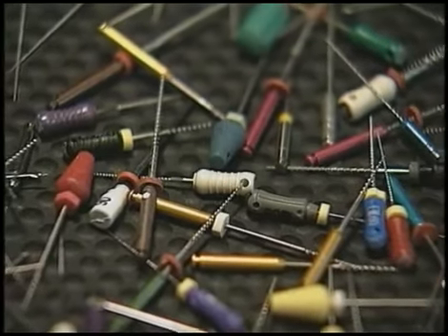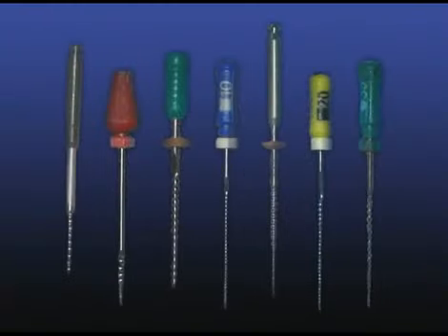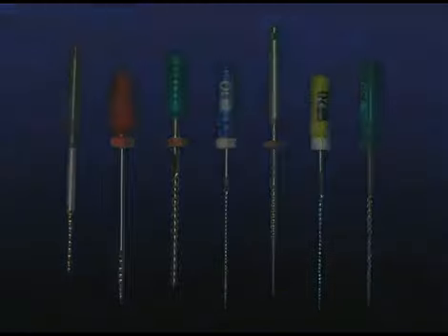Today, virtually any instrument can be removed by most clinicians, even if it only partially lies in the straightaway portions of the canal. Most clinicians would think of files when we say broken instruments, but the term also applies to the tip of a silver point, the core of a thermophil carrier, a Gates-Glidden burr, a Lentulus spiral, or any man-made obstruction left behind in the canal. This tape will deal mainly with files as obstructions since they are the most common offenders.